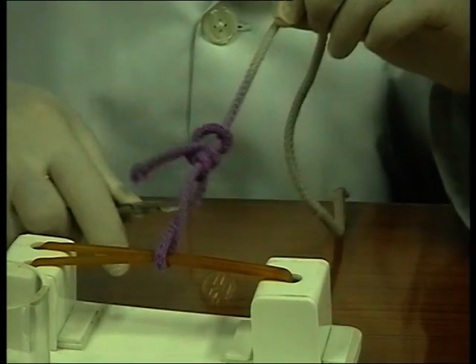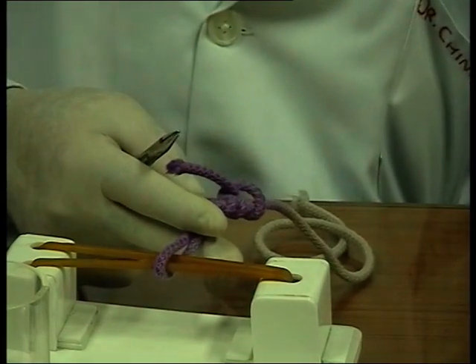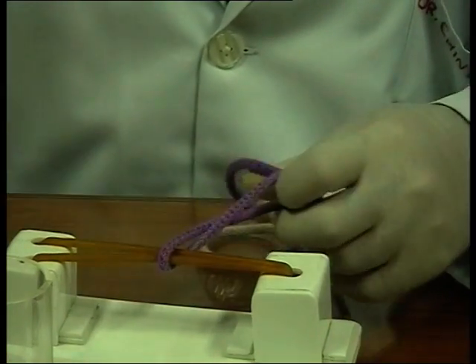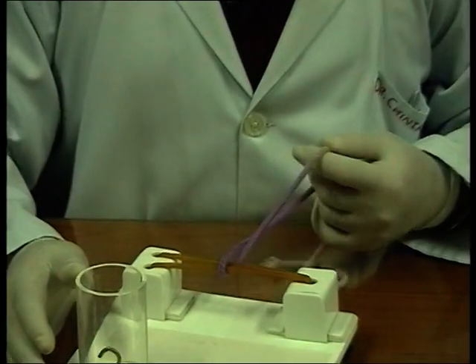And if it cuts itself here, the whole package comes out and the abdomen opens up. If you think knots don't slip, they always slip, but the patient goes to somebody else. He has to deal with it. So you would never know that there is a knot which has slipped.